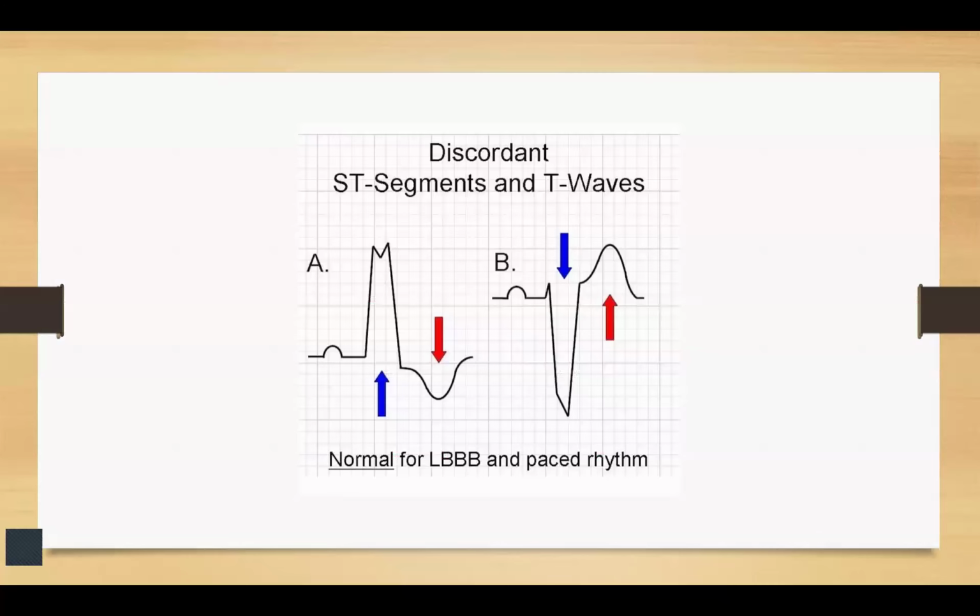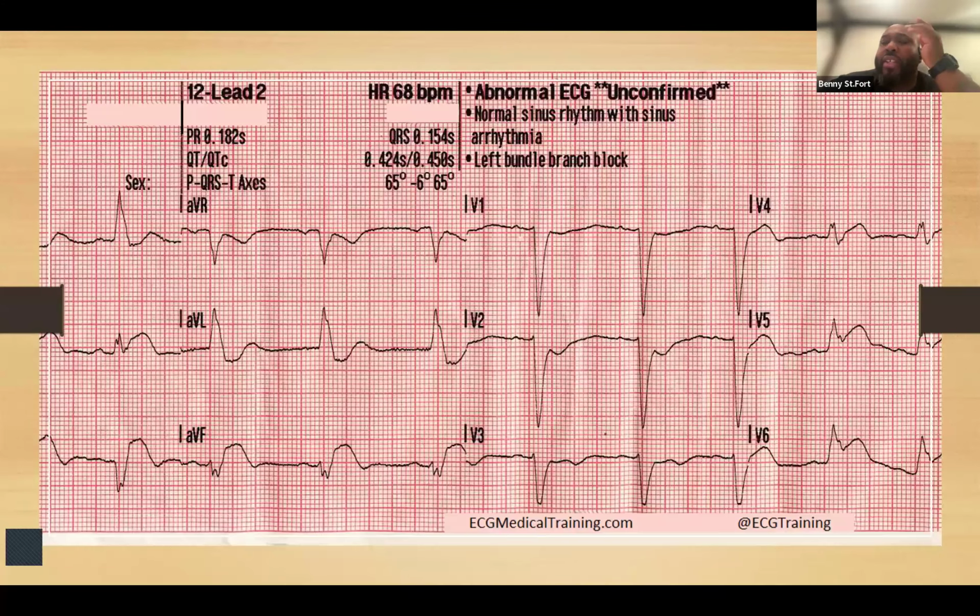So just a quick review. Can you go back to that EKG? I know Michelle said that you have the ST depression in V2.